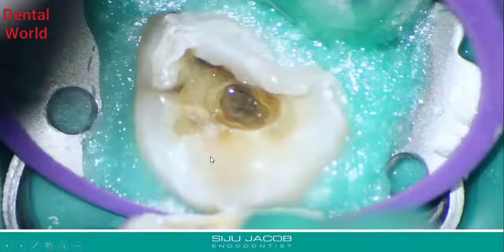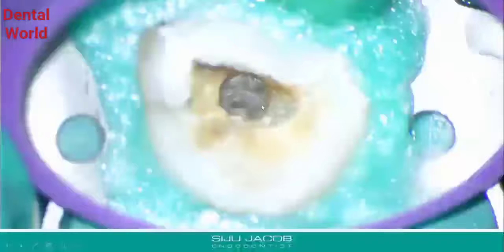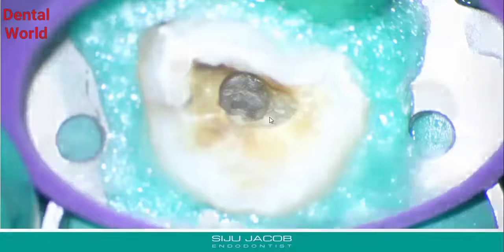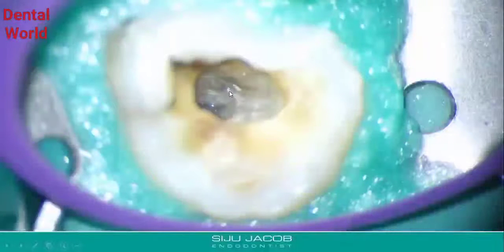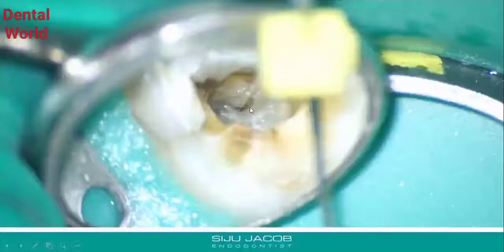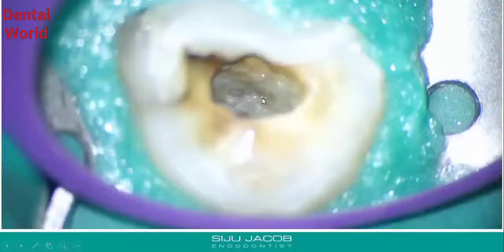Once we have that information, we clean out the water, dry it, and ask, what's the first step? The first step seems to be that it's okay to remove this calcified portion, because you can see this is a calcified pulp chamber. So the first thing I would do is remove this calcified portion and see what's underneath, which is what I did. I drilled through this area, and once I drilled through this, you can see a K file there and a small catch there in what seems to be a canal.